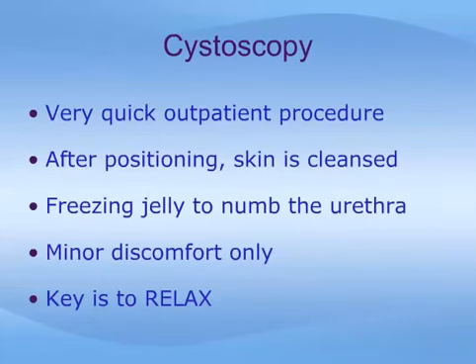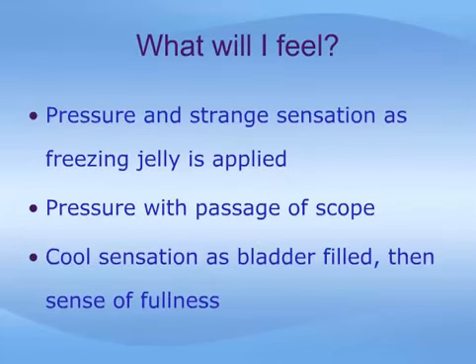Cystoscopy is usually a very quick outpatient procedure. After positioning, the skin is cleansed and freezing jelly is passed into the urethra to numb sensation. Most patients should experience minor discomfort only, which is minimized by taking deep, slow breaths and relaxing as much as possible. You may feel anything from a cool sensation or pressure in the urethra to a slight burning sensation with passing of the freezing jelly. Some patients describe it as feeling like they are urinating backwards.